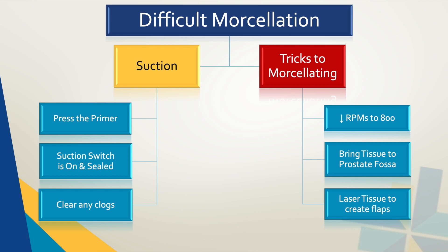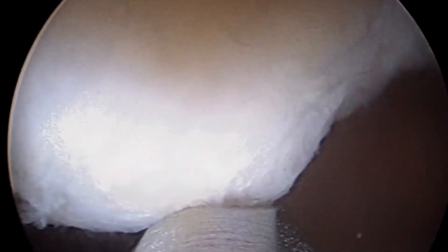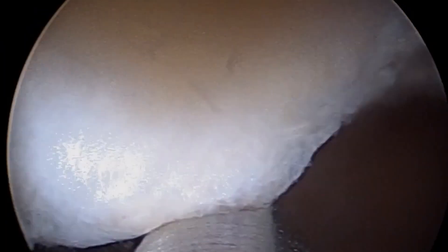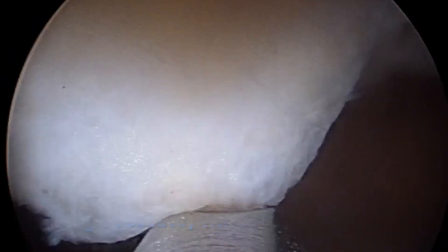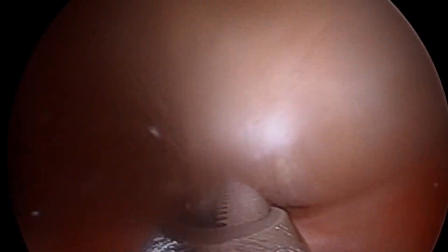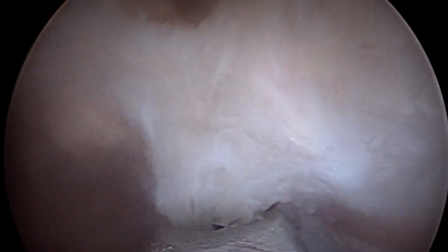Sometimes the suction is not the issue and you are still not able to morcellate. This can be due to a number of causes, and there are a few tricks we have found to be helpful in this situation. To demonstrate the scenario, we present a patient with a 225 gram prostate gland that had previous high-dose radiation therapy for prostate cancer. As you can see in this video, despite adequate suction, the tissue was not engaging with the morcellator and we utilize each trick in this patient.